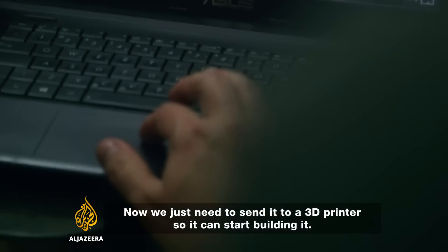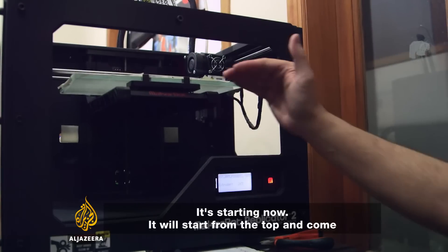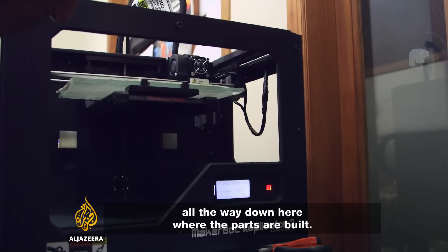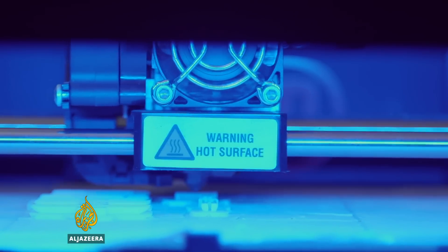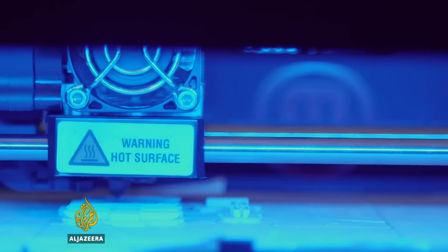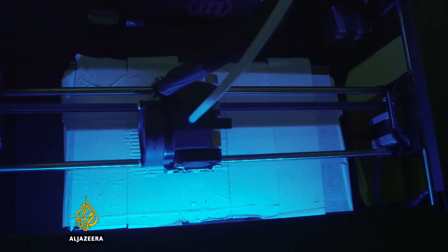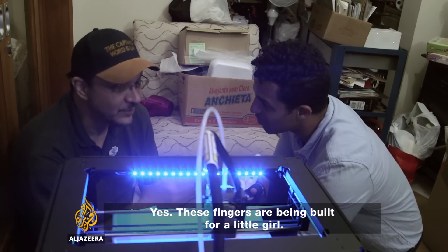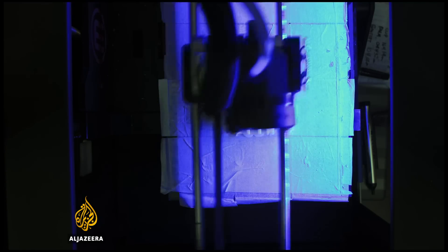You have to send it to the printer to make it start to build. It starts from above and it goes down until the model has been fully built. 3D fingers are created by having successive layers of plastic laid down in the shape of the design. Each part of the hand is printed individually, and the whole process takes Felipe about 72 hours.